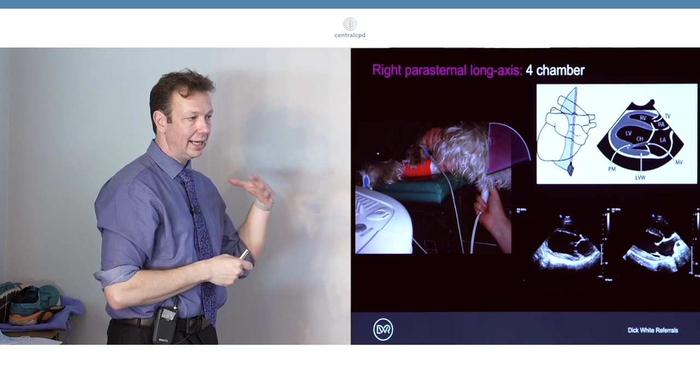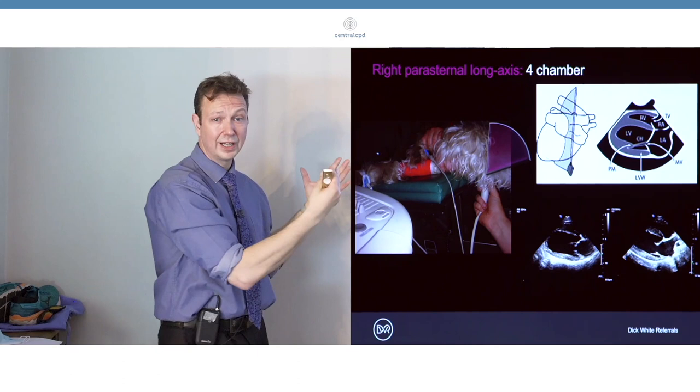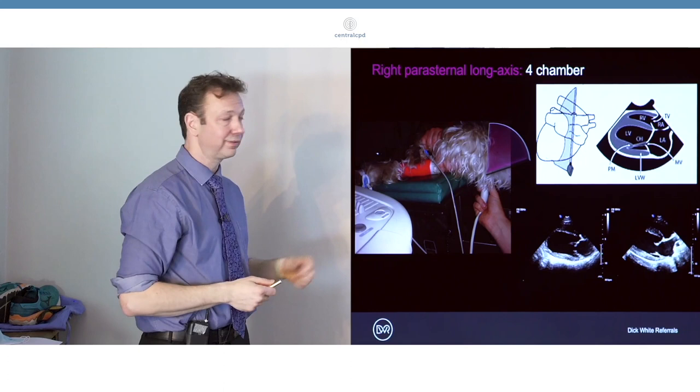As you're gaining confidence, if you're just looking at the atria, why not narrow the sector and just narrow it down to the atria and then just do the same for the ventricles. Then you'll increase your frame rate. A wide sector decreases frame rate.